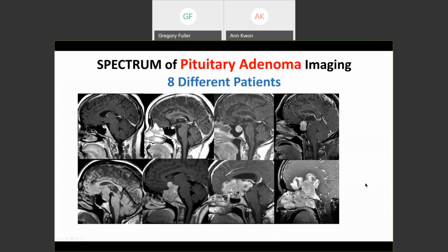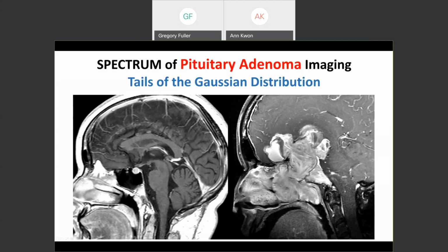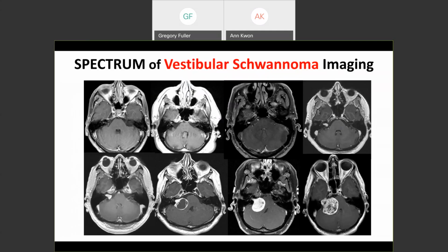Now here's the point. The pathologist, the radiologist has to recognize in their differential diagnosis that pituitary adenoma can range from this, or the smaller, even smaller hypo-enhancing, even invisible, where you might have to do inferior petrosal sinus venous sampling to even identify the side, to this, to the one on the right. That is the spectrum, at least the size spectrum, of pituitary adenoma. All right, I'm sorry, one more example. I just can't stop doing this because I think it's important to show the spectrum so you don't get fixed in your head that there's only one cerebellar hemangioblastoma, a big cyst with an enhancing mural nodule. Yes, that's the most common pattern of symptomatic cases, but there's a wide variety.